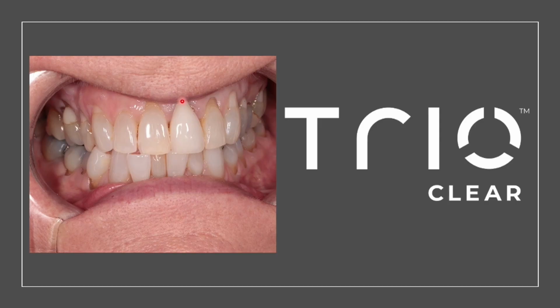The alignment is actually very straightforward here. We can tackle that lower alignment with clear aligners with relative ease, and then it corrects the crossbite, which then allows us to get in here and restore these two teeth here with veneers, which is ultimately what this lady wanted.